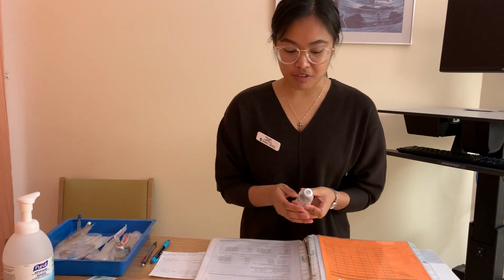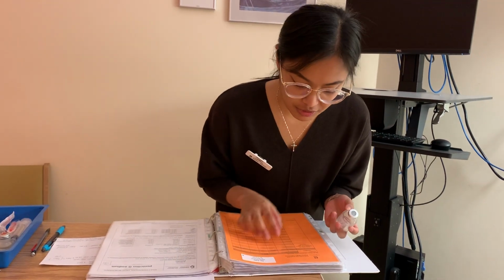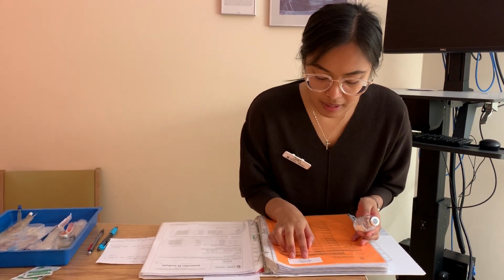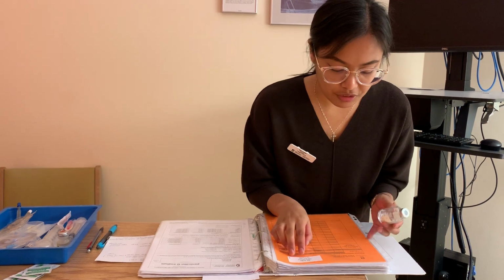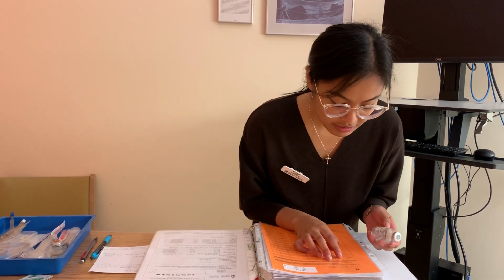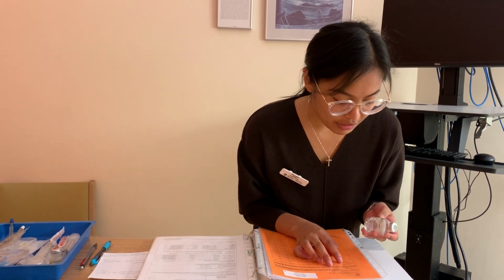So I'm going to do my first med check with my MAR and my medication. So patient Erica, MRN 0091314, born May 5th, 1980, with Dr. J. Ames. Again, she has pneumonia, allergies is shellfish. Current medication, Penicillin G. Right dose is 2.5 million units. We have a 5 million unit vial, so we can pull it from here.